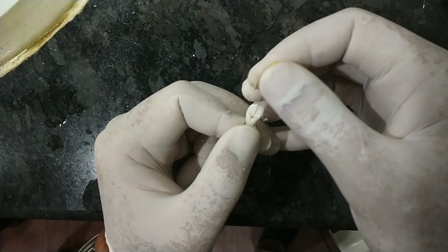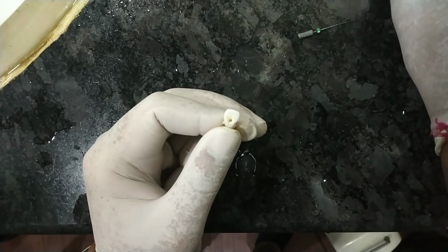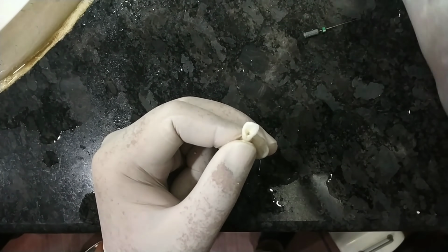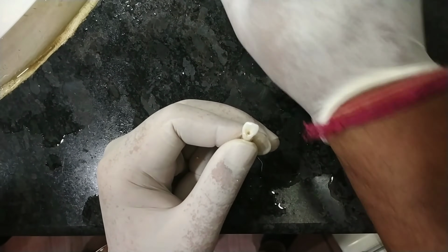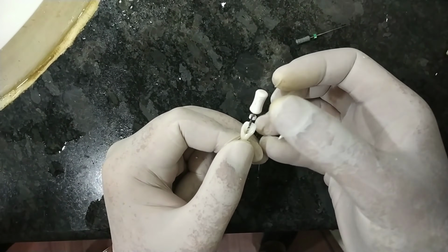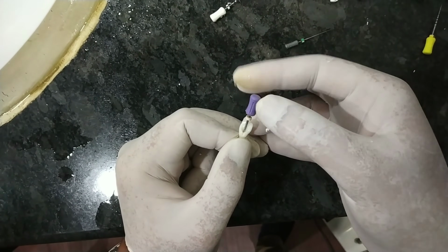Here I am giving just one stroke, but you have to give around 10 to 15 strokes so that the walls of the canal are very smooth. Then again, after each and every step, don't forget to irrigate the canals properly. After irrigation, now you are sure that you have achieved the straight line access. You first use the shaping file and just insert it. This is S1, the purple one.